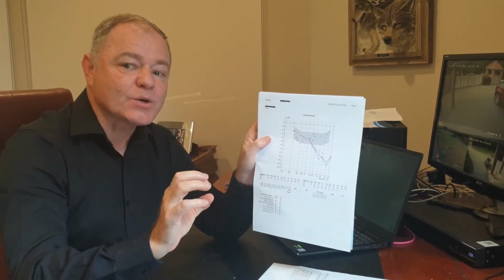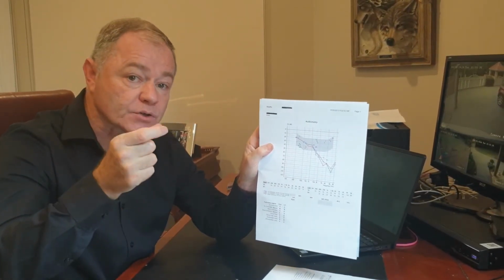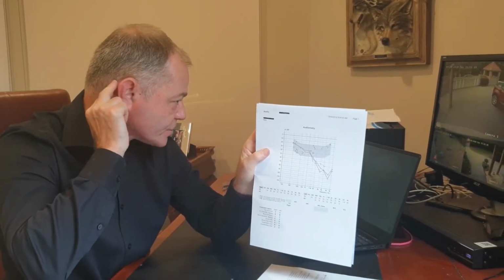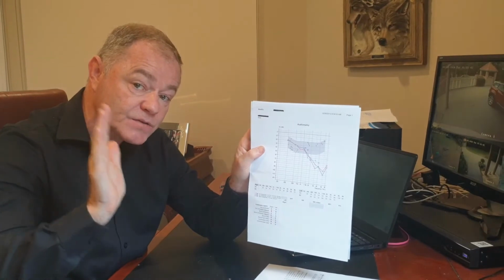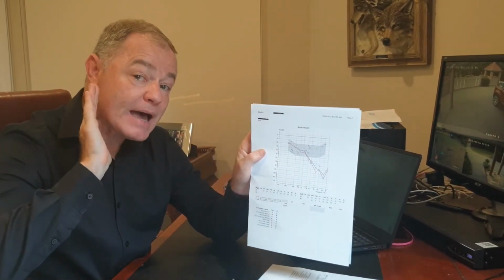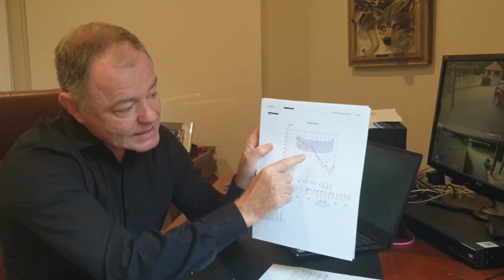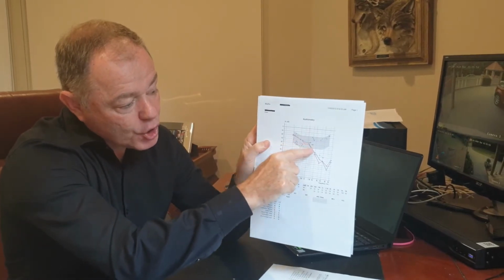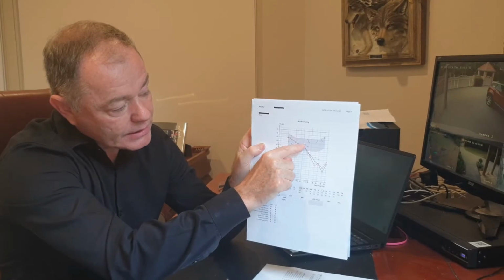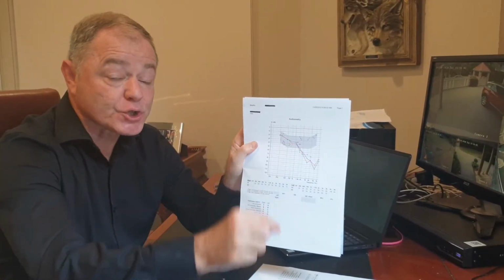The second test that we'll do, we use what's known as a bone conductor. And a bone conductor is a little vibrating pad that just sits on the bone behind your ear, on your skull. And in this case, the sound is vibrated through the skull directly to the cochlea. So we're bypassing the middle and the outer ear. So in this case, we then plot not just these noughts and crosses, which are the right and the left ear, but we also plot little brackets. And in this case, the brackets are exactly the same as the noughts and the crosses.